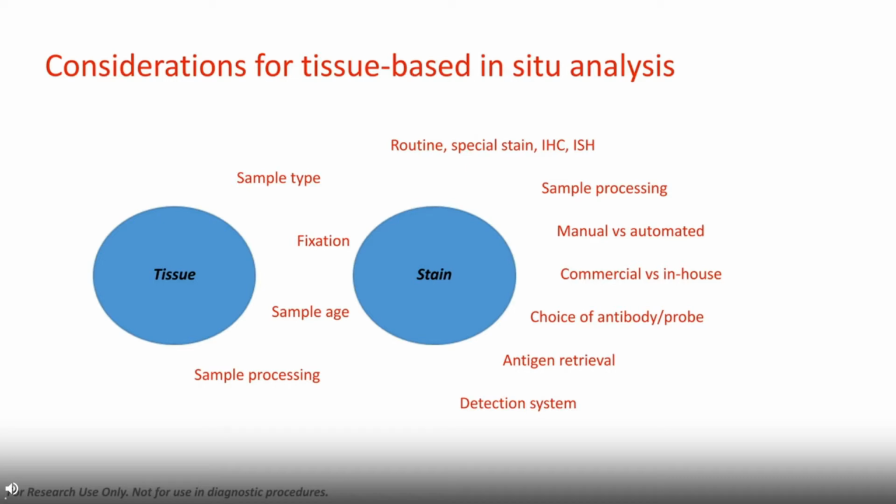And if possible, simplifying, standardizing, and automating these processes makes it much easier to compare assays and to really interrogate the tissue in an appropriate manner. And in our lab, a great example of this is looking at HPV status in oropharyngeal cancers.